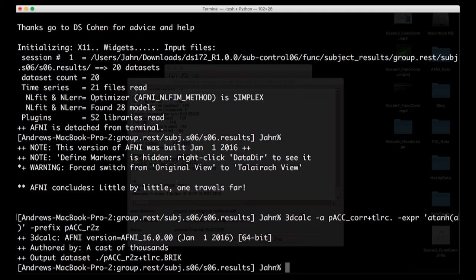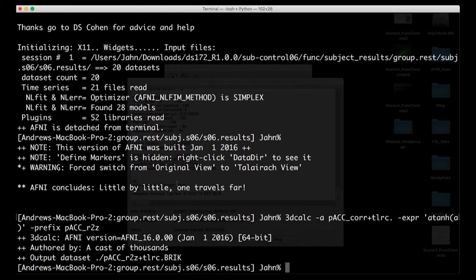Once you have these, you can use these for a second level analysis. Once you've converted all of these correlation maps to Z maps for each subject. And if you've done it for task-oriented analysis, the procedure is exactly the same. Feel more like you know what's going on now? We've only covered one method today of analyzing resting state data. Other methods include things like independent components analysis, clustering, and something called graph theory. So if you want to learn more about those, click on the blog post down below, which will give you links to each of those methods. And we'll also have a series of exercises covering what we talked about today.